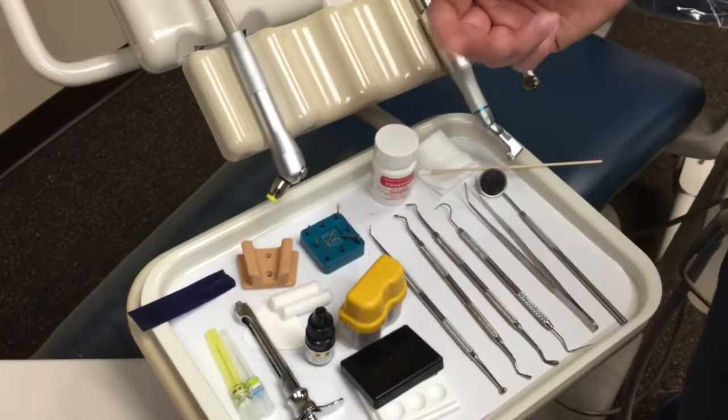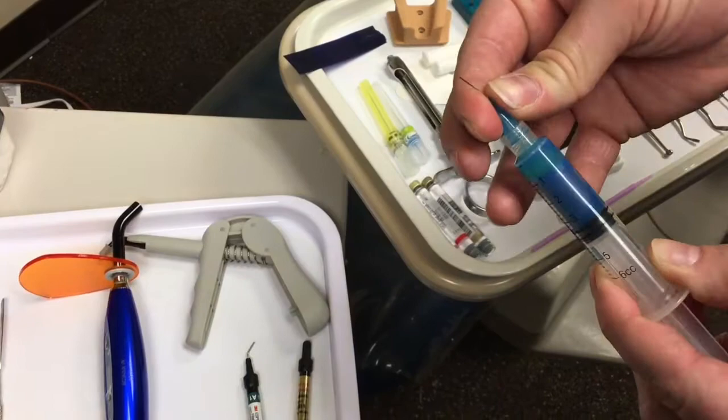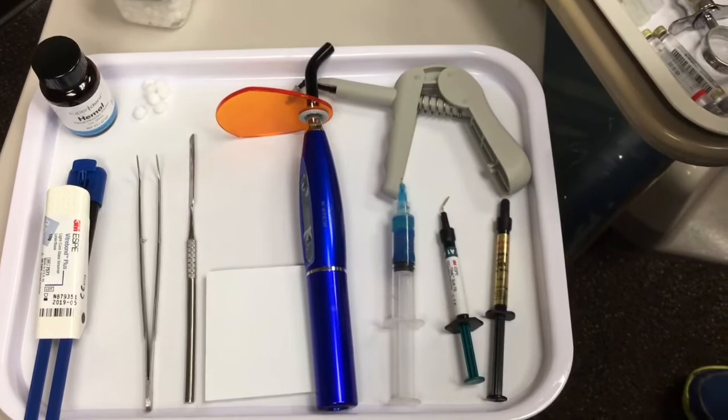After that, we want to go ahead and rinse out the tooth and then dry it. The first material we're going to be using is etch — this blue stuff. These are one-time use tops, so we always want to make sure they're being replaced after the procedure. I always make sure these work by squirting a little bit on there first and then handing it to the doctor. The etch stays on for roughly about twenty seconds, and then we'll want to rinse and suction all that up, being careful that none of that etch gets on the patient's tongue or throat.